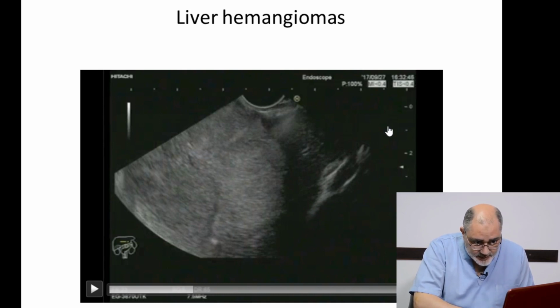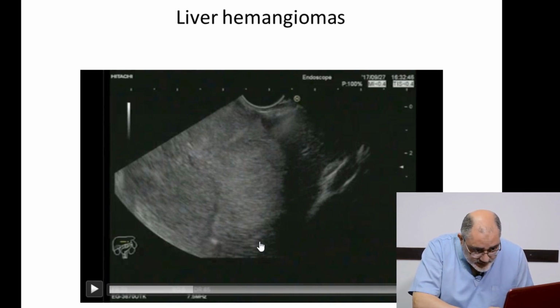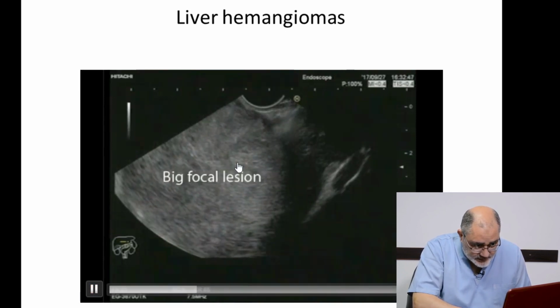And here we are expecting the ligamentum venosum. So the fish eye appearance is the umbilical portion of the left portal vein, and to the left of the screen is the ligamentum teres, and to the right of the screen is the ligamentum venosum. Here this is the ligamentum teres. The segment above is segment 3 and below is segment 4B. So this lesion occupies segment 3, and segment 2 in the previous view, and also extends to segment 4B. So this very large lesion occupies segments 3, 4B, and 2.